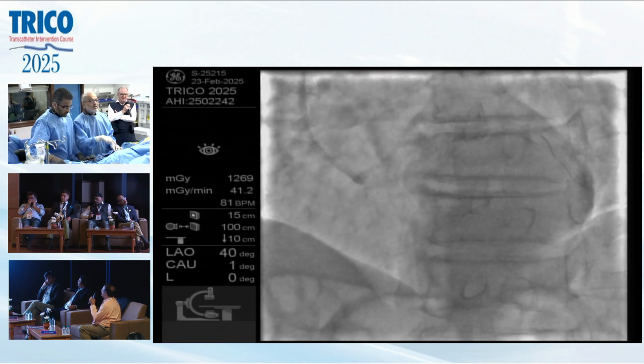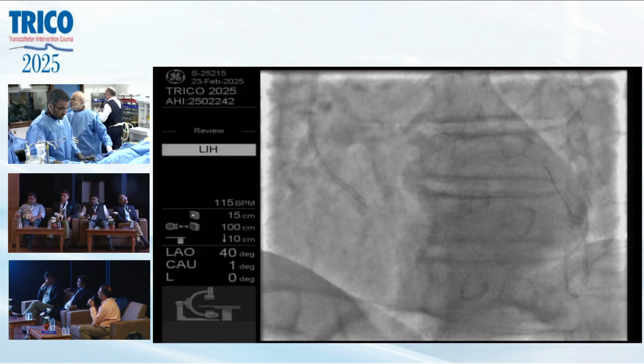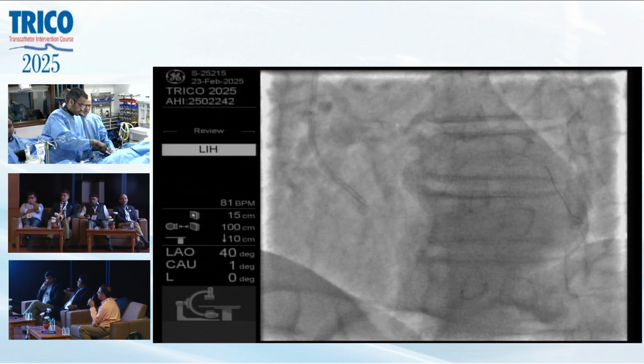Okay. I have a question for Dr. Akasaka if he's able to hear. He's a basic scientist. Is there any difference in the wall histology of these anomalous vessels?